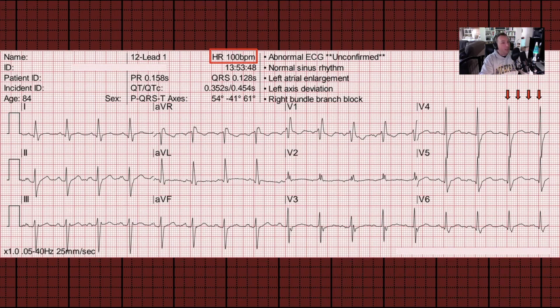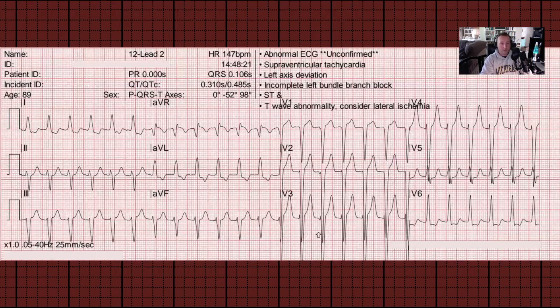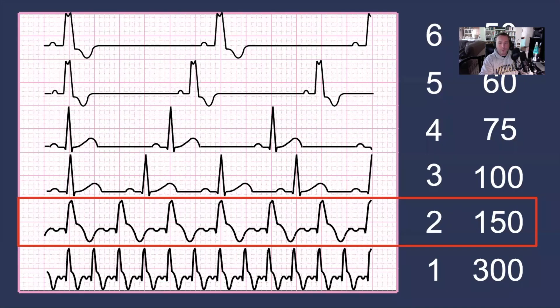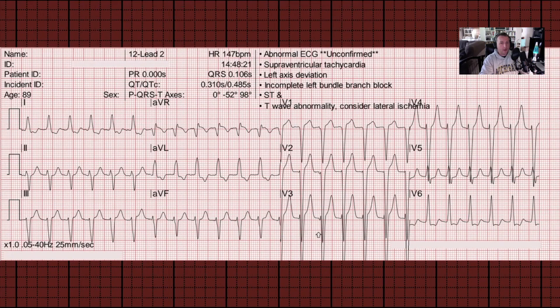Let's go even higher and look at an ECG with a heart rate very close to 150. The computer is measuring this heart rate at 147. For heart rates very close to 150, we should have about two large blocks in between cardiac cycles. Picking an R wave in lead aVR and counting: one, two large blocks in between R waves, proving that this heart rate is about 150.